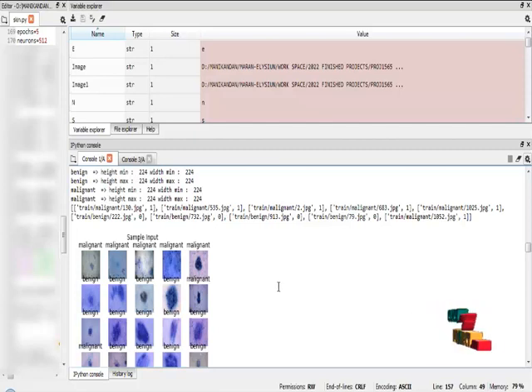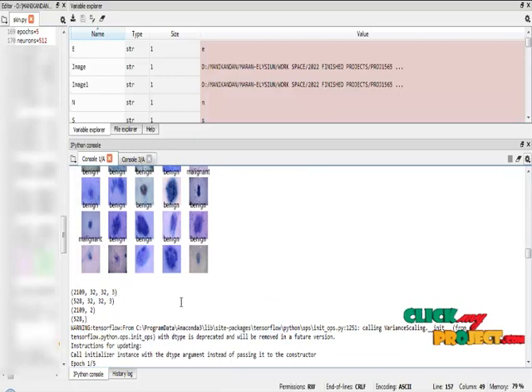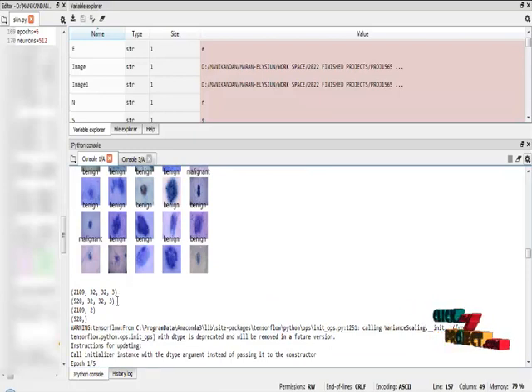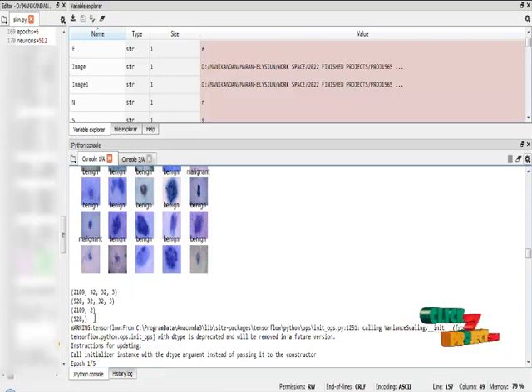After that, I am going to select the independent variable and dependent variable, and then convert it into an array. After that, I have to view the sample images for the benign and malignant classes. This is the independent variable training data and independent variable test data shape. And this is dependent variable training data and dependent variable test data shapes.